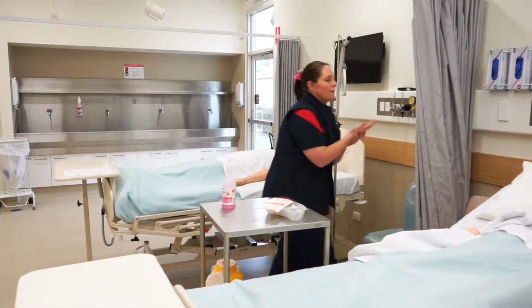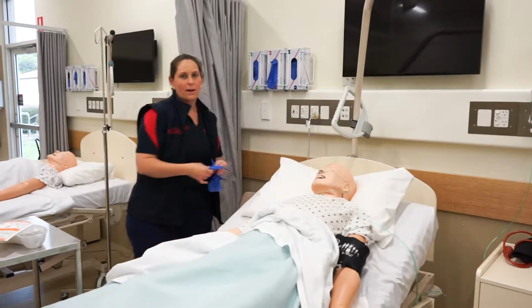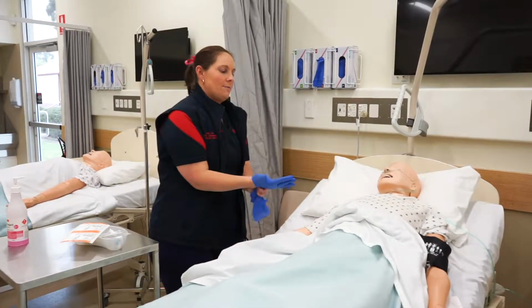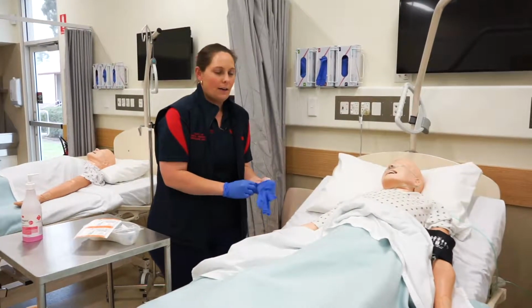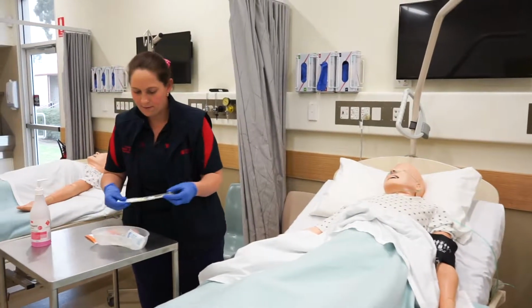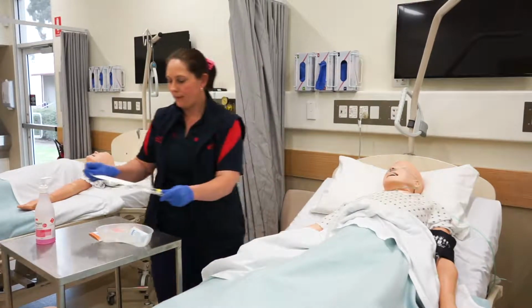So can you talk us through what you're doing? So I'm just going to give this patient a subcutaneous line into his abdomen. So it's often used in palliative care patients so that we can administer medications without having to continually give injections to a patient. So this catheter actually can stay in the patient for up to 7 days. So I'll just get all the area all ready. It's a little bit more comfortable for the patient.